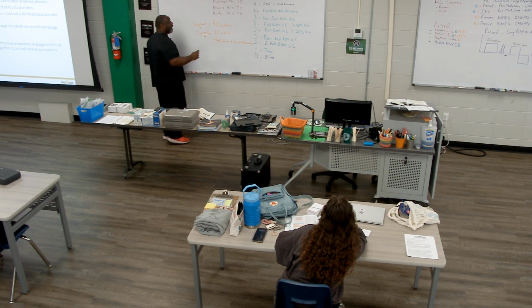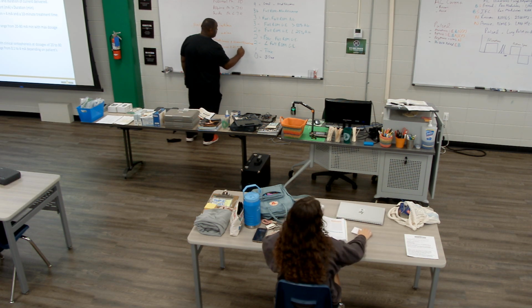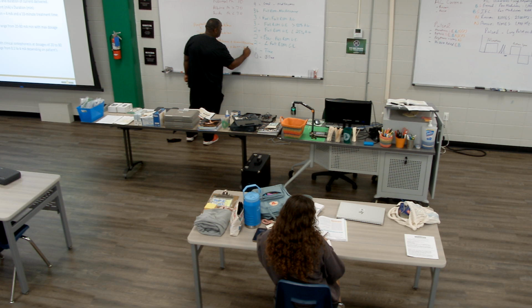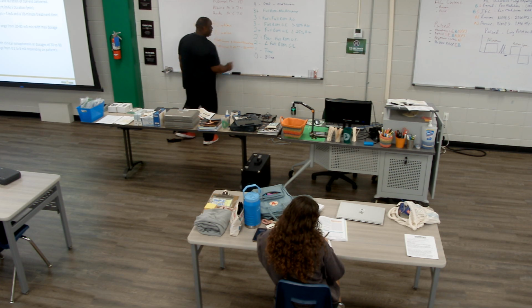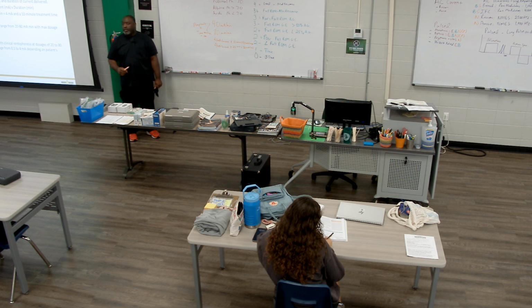If I wanted an 80 milliamp minute dosage, I would do 4 milliamps times 20 minutes. The objective is either 40 or 80.